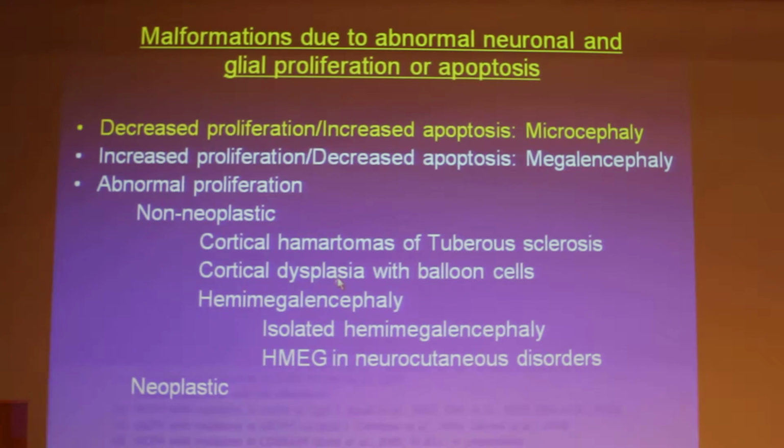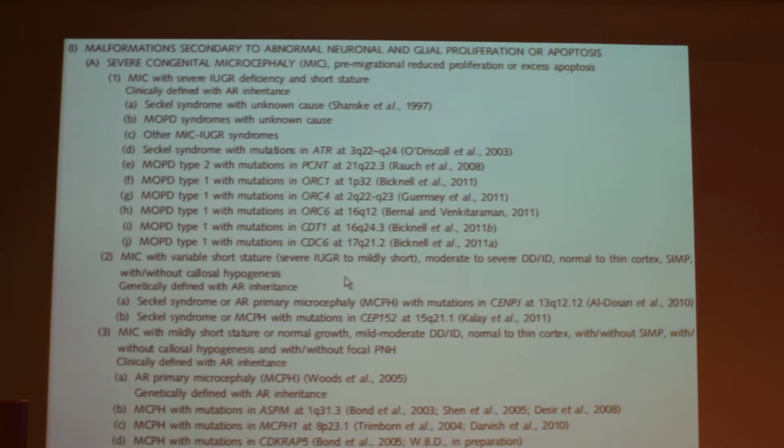So we'll just take a couple of groups. This is just part of the differential diagnosis of microcephaly today. I think microcephaly is probably the hardest diagnosis to make prenatally.